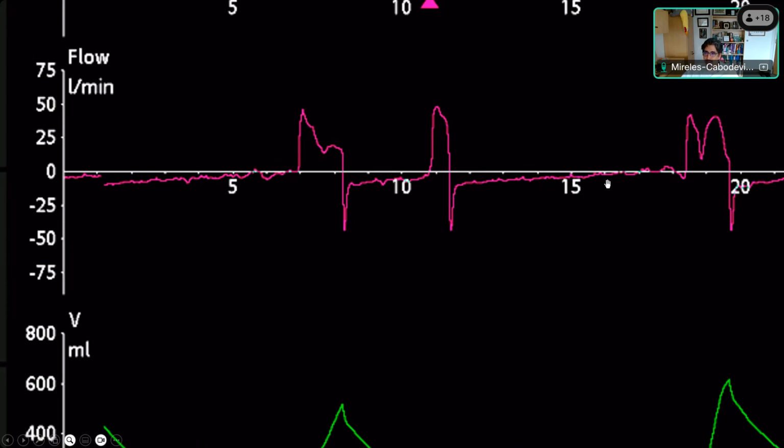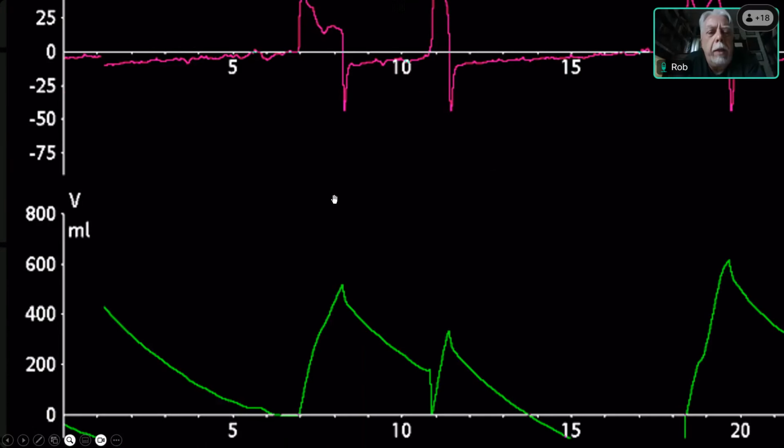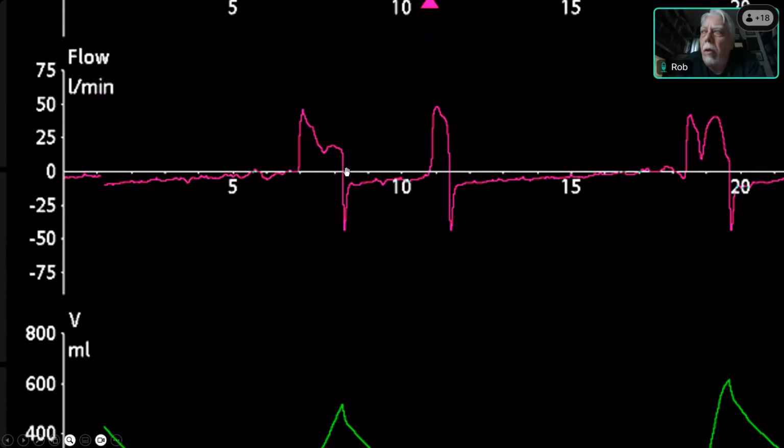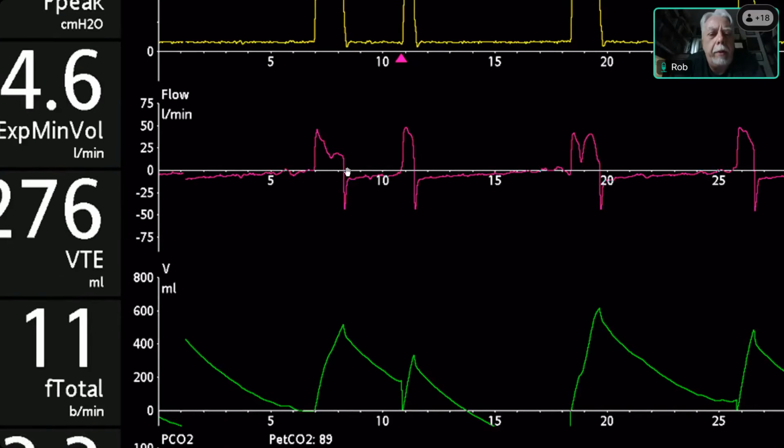Rob? Yeah, that really is two time constants, because the patient circuit has a very low compliance and a very low resistance, very short time constant. And the area under the curve is basically the gas that was compressed during inspiration. It's a very small volume. And so you can see how very little volume came out during the first peak. You see that, and then it takes a long period.